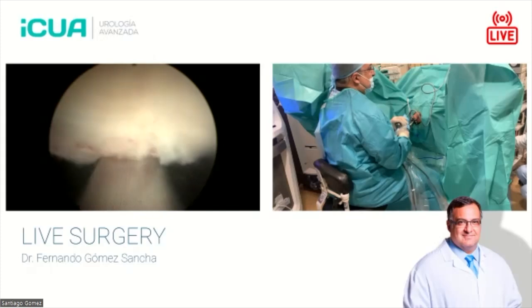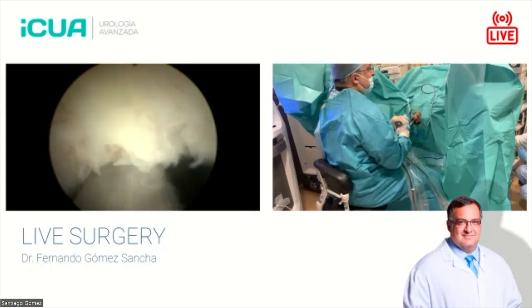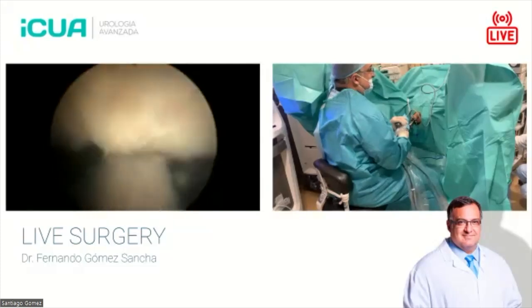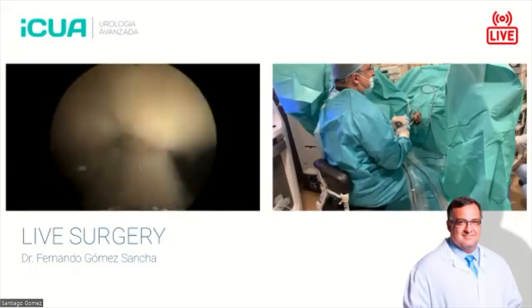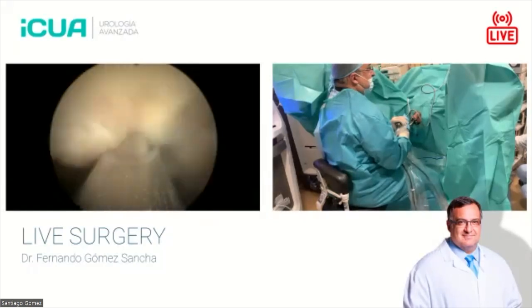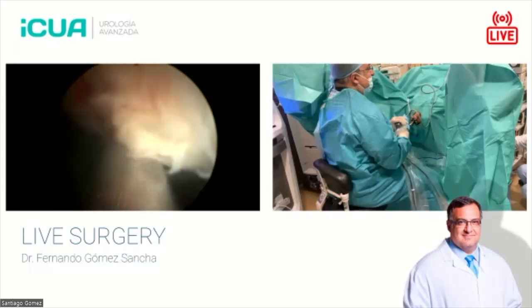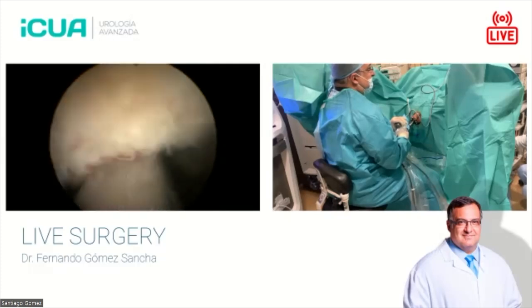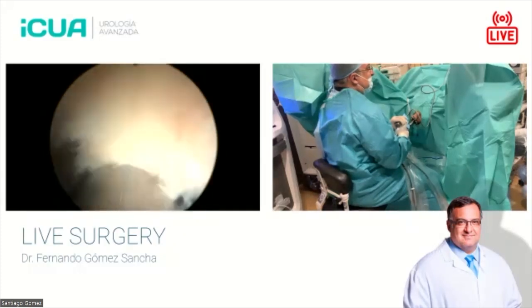Many people use two irrigation sets, four bags, using both entries in the nephroscope. I use only one usually, because I think it's simpler, but I pay a lot of attention to the quality of morcellation, because when morcellation is good, as it is now, you will see that most of the time the mouth of the blade is obliterated by the tissue. So there's going to be some water coming out, but not too much. And there's going to be a lot of tissue coming out.